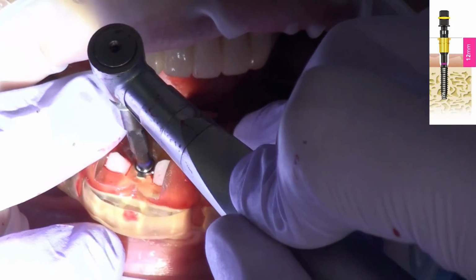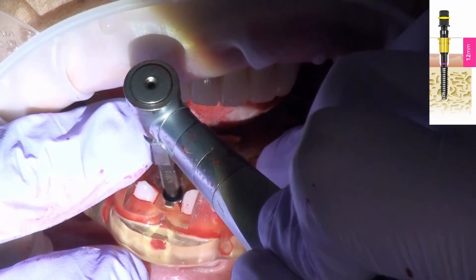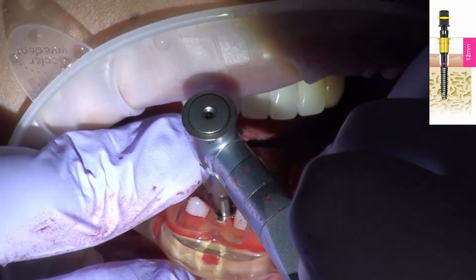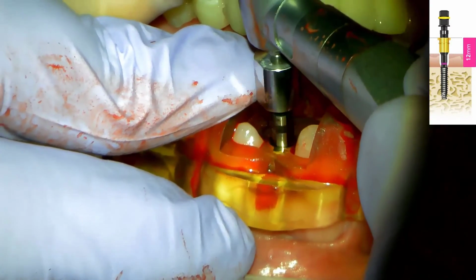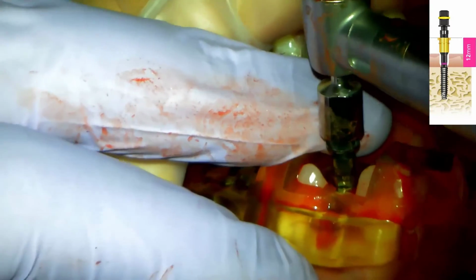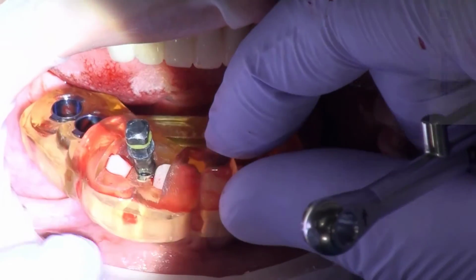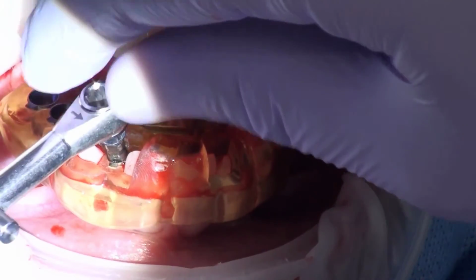As you know, the kit here is a 12 millimeter offset. That is the narrow. It's already showing some torque, and it has a ways to go, but I'm optimistic that I want this torque value. Still going. I'm just about there, and obviously, so I have about 1.5 millimeters left. I'm going to go ahead and use the torque wrench to do this. Now here's something unique with the DO system. I do need to line up properly with one of the indicators on the guide sleeve. As I get closer, I'll point that out.